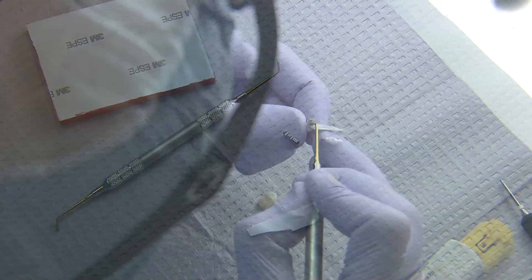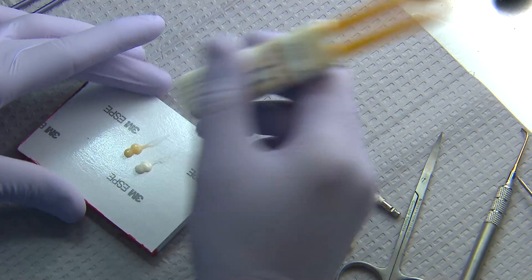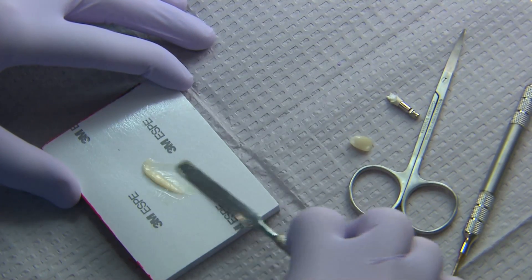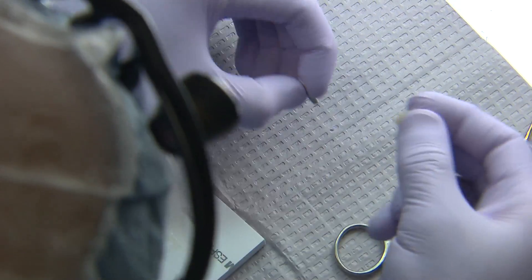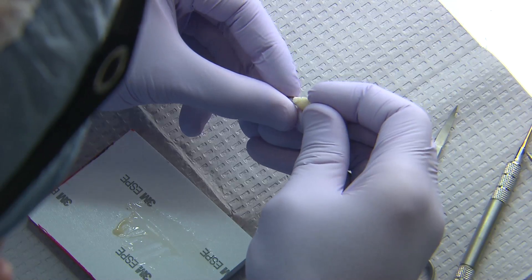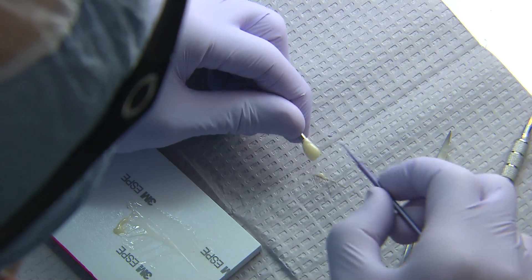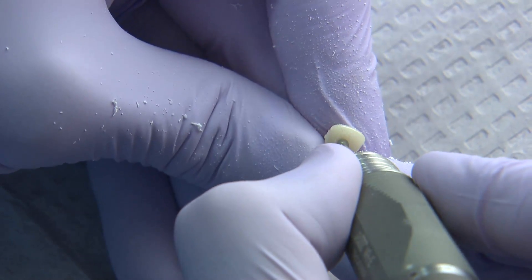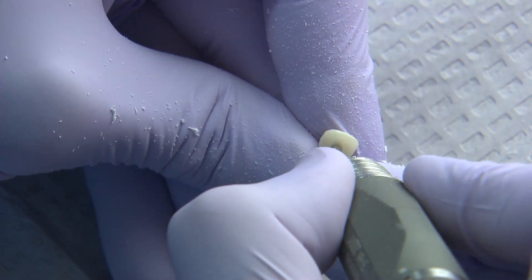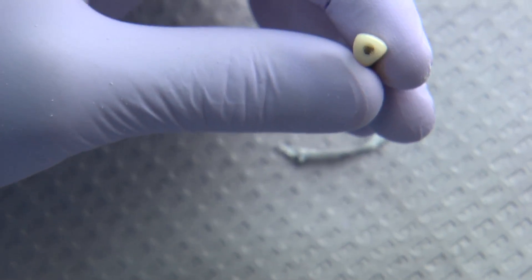At the time of the surgery, I felt comfortable loading this implant because of the stability. What I'm doing here is converting the cement-retained temporary crown into a screw-retained one. I utilize a resin cement and bond the temporary abutment to the temporary crown — almost reverse engineering this — and create a hole where the screw access is. Before cementing, I covered everything with Teflon so I can remove it and now have a screw-retained crown ready to be delivered at the time of implant placement. It not only serves as an aesthetic temporary restoration, but also helps the gingiva and tissue form around the implant.